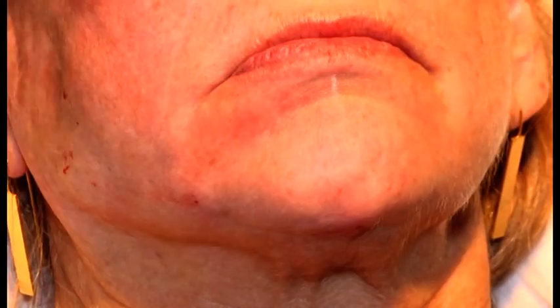All right. Okay. So that concludes chin augmentation. Now, of course, we have to include also one little bit of needle. Can I have a 27 gauge, a gray needle? The gray needle? Yeah, great, thank you.